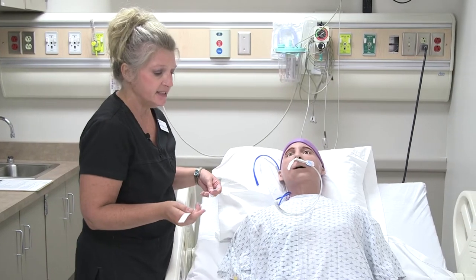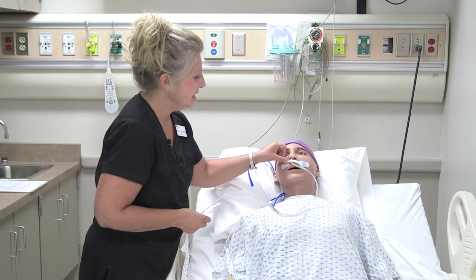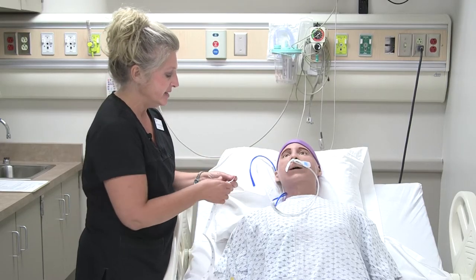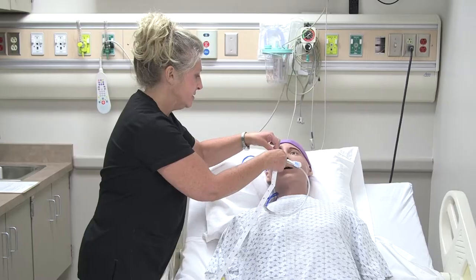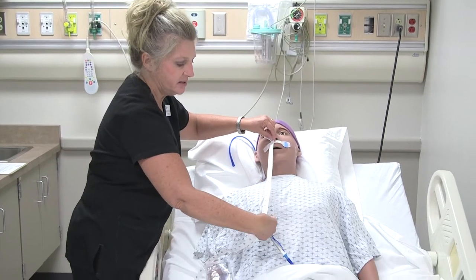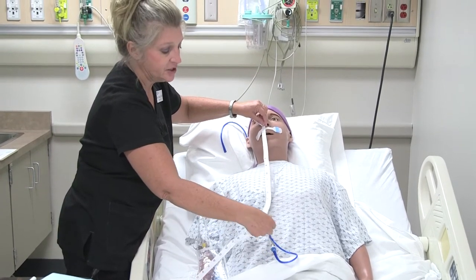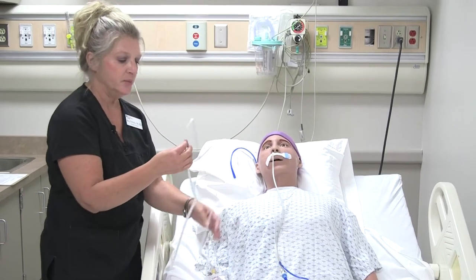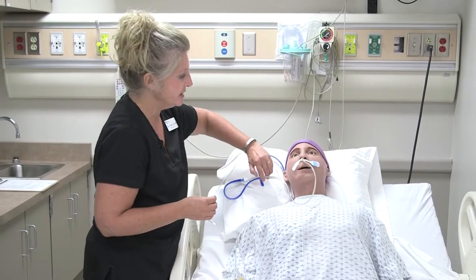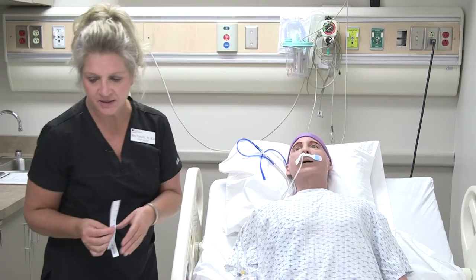Once it's been verified that the tube is in the stomach using an X-ray, you would mark the tube right up to the nares where it's inserted and measure it. You would measure how long the tube is coming out of the nose to the end, then document that in the patient's chart so each nurse can measure it and confirm the measurement stays consistent, confirming the tube hasn't moved.